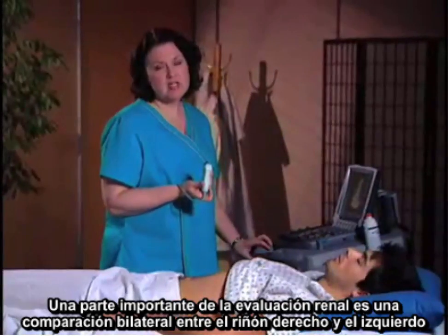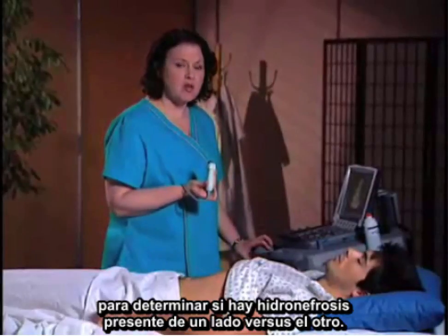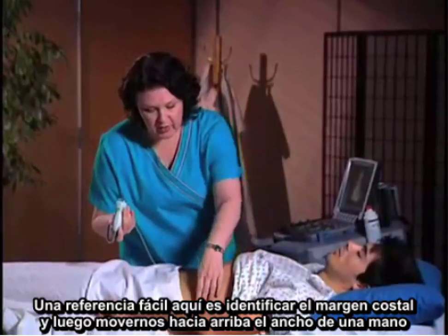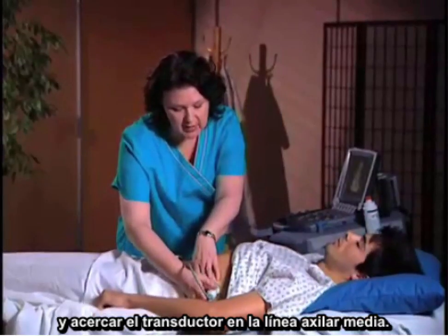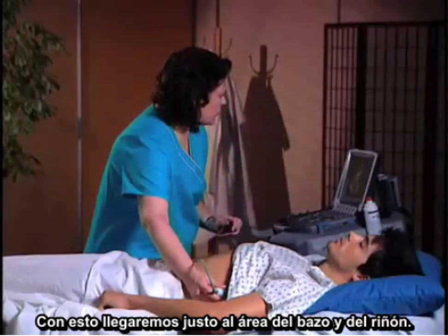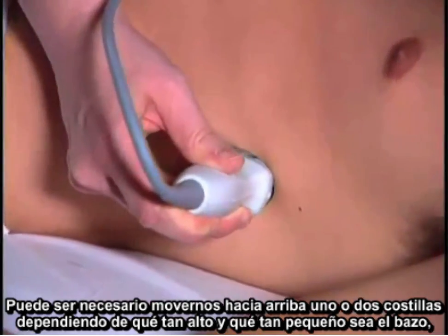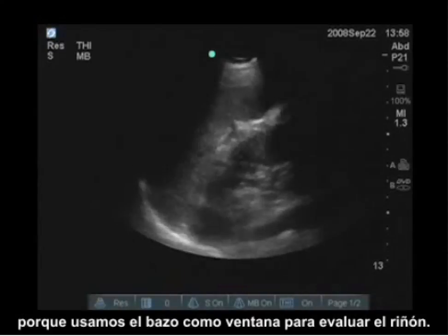An important part of the kidney evaluation is a bilateral comparison between the right and left kidney to determine if there's hydronephrosis present on one side versus the other. So we'll go ahead and do the left side as well. An easy landmark is to identify the costal margin, then move up one hand's width and bring your transducer in at the mid-axillary line. This should get us right in the area of the spleen and the kidney. You may need to move up a rib space or two depending on how high and how small the spleen is, because you're using the spleen as your window to evaluate the kidney.